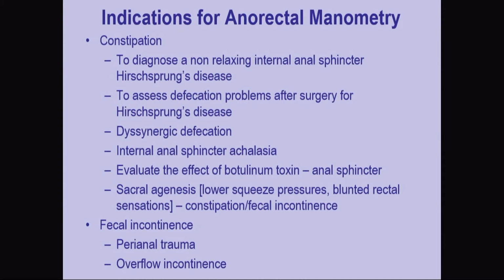Patients who may be suspected to have internal anal sphincter achalasia or the effect of botulinum toxin, or children with sacral agenesis, will usually all present with constipation. In fecal incontinence, in patients with perianal trauma or overflow incontinence, may be referred for anal manometry.